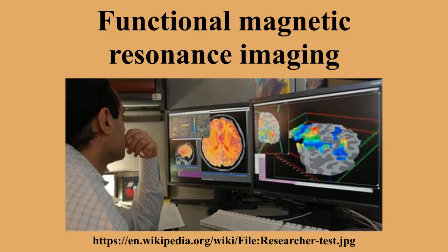Linear addition from multiple activation. When a person performs two tasks simultaneously or in overlapping fashion, the BOLD response is expected to add linearly. This is a fundamental assumption of many fMRI studies. Linear addition means the only operation allowed on the individual responses before they are combined is a separate scaling of each.